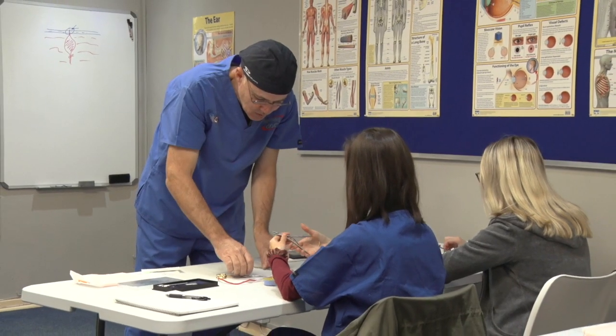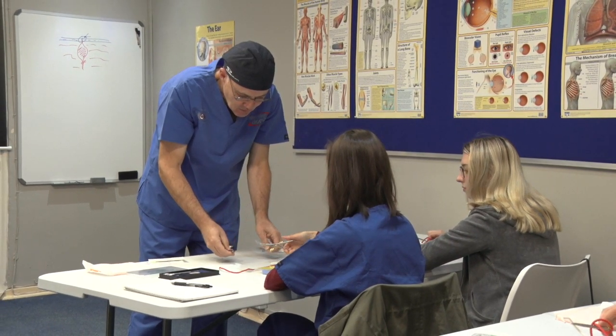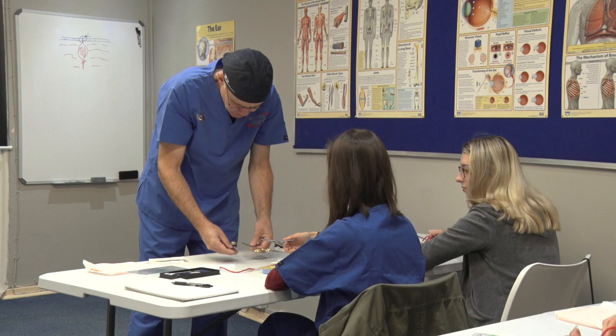Following his proven teaching methodology, instructors can teach even the most challenging group of novice students respectable suturing skills within 3 hours.